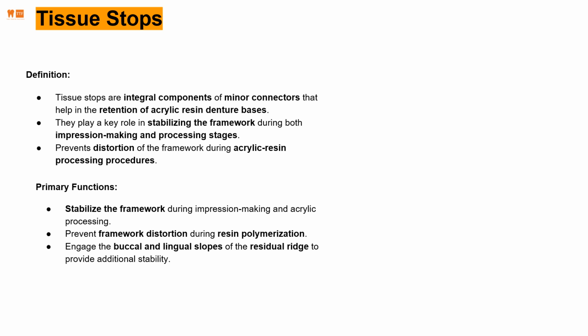Remember, tissue stops are an integral component of the minor connectors. It is a type of minor connector. It helps and plays a role in retention of acrylic resin denture bases. Play a key role in stabilizing the framework during both impression making and processing stage. It just keeps everything away from distortion during acrylic resin processing procedure.